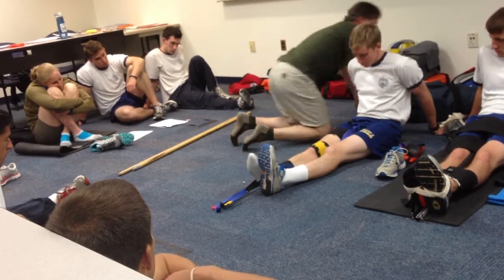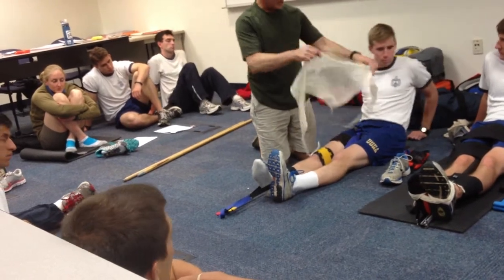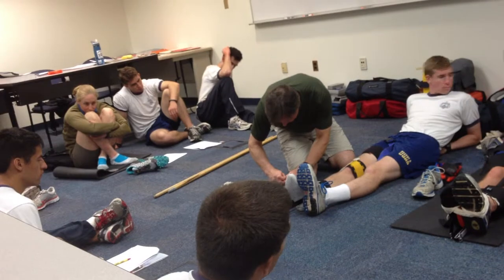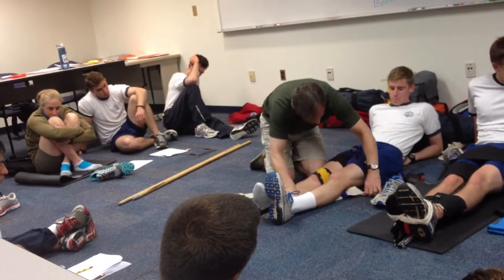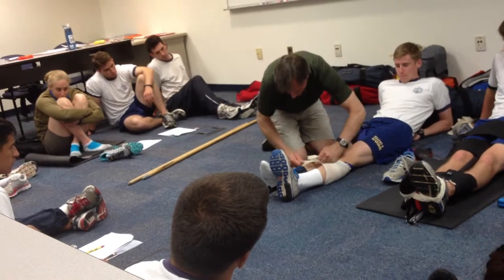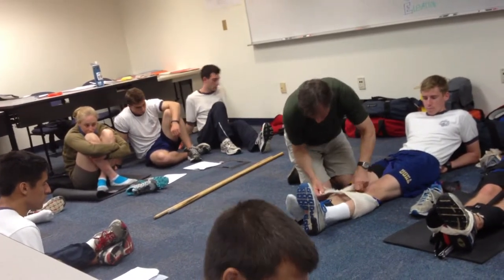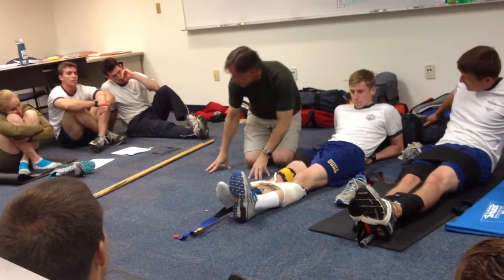What I also like to do to help beam the patient onto the backboard is to do some anatomical splinting — basically using those triangular bandages just to try to help keep things a little bit snug. Minimizing movement, because it's the movement that could potentially cause pain as the bone ends grind against each other with the crepitation, or against the tissue.